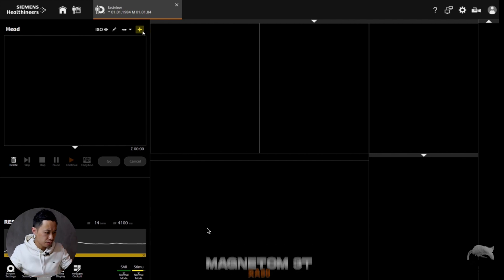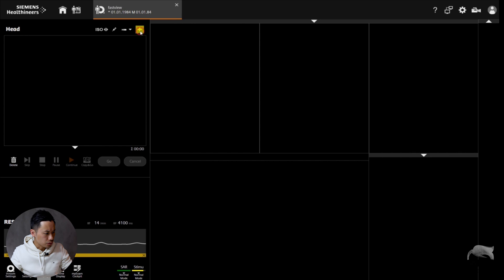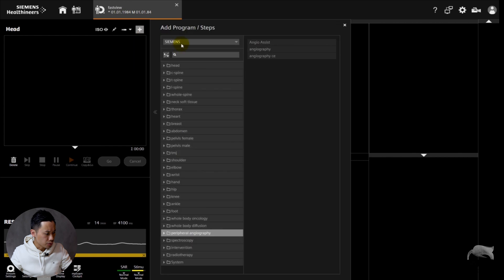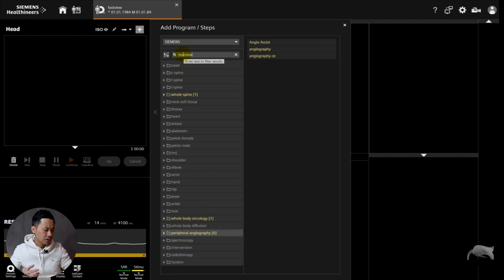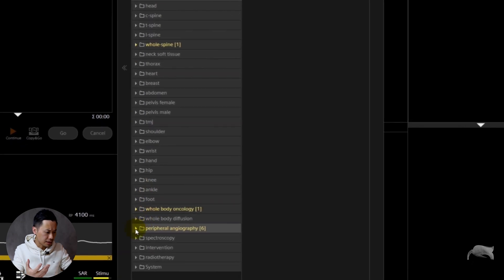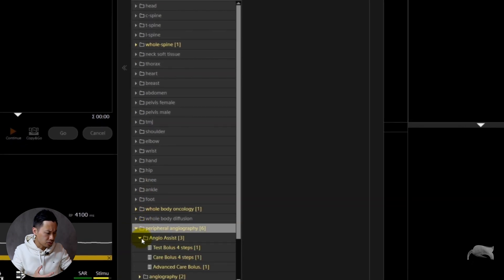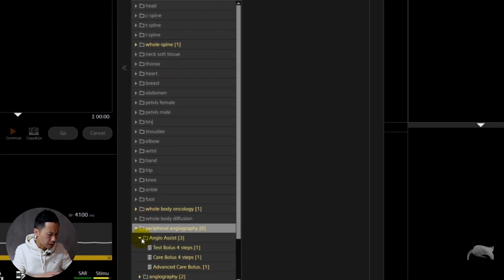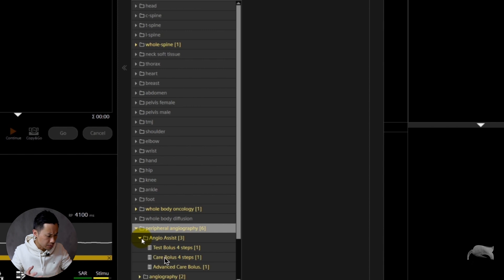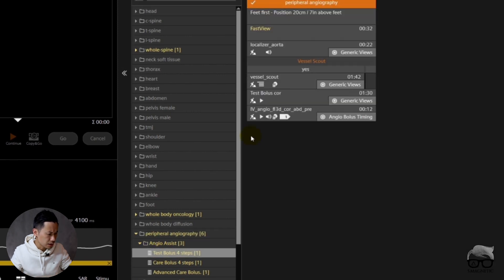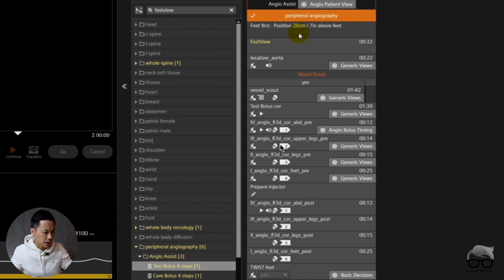We are currently at Magnetom 3T. How do you know if you have it or not? First thing you can do is go to the protocols and just write Fast View. If you have it, it will be available. Let's go to peripheral angiography. You can see we have Fast View localizer right there.